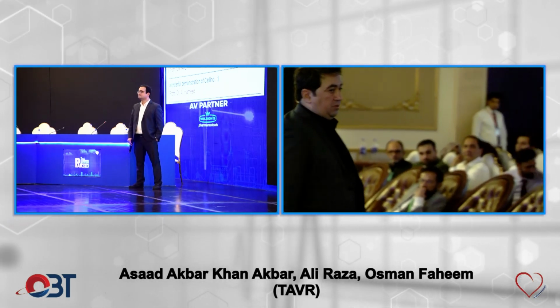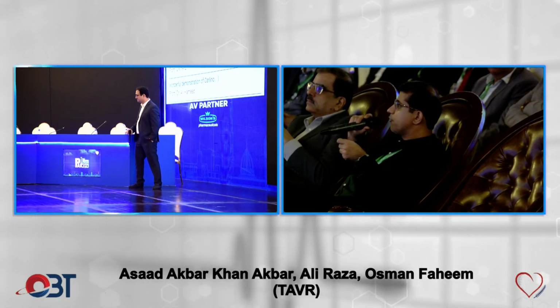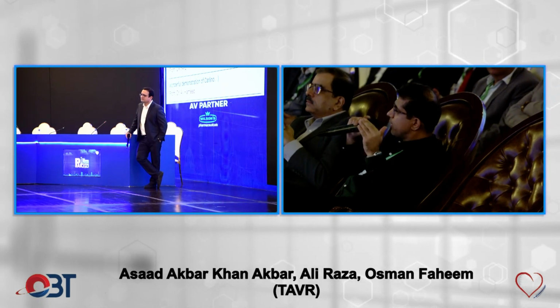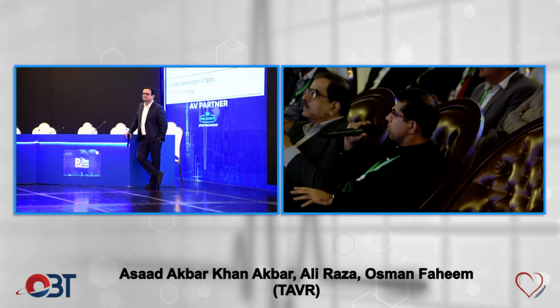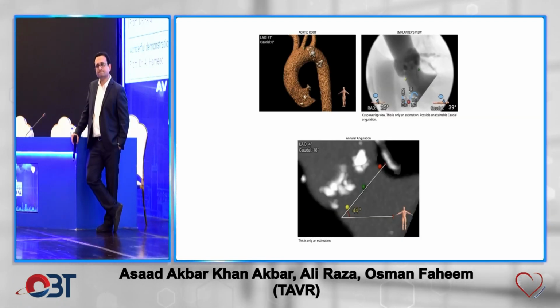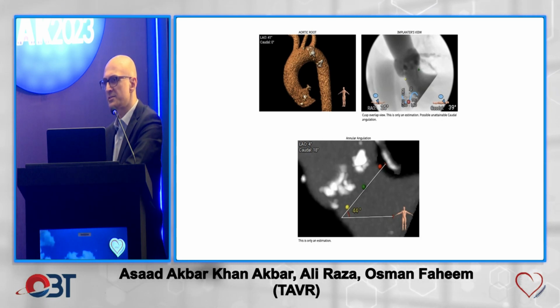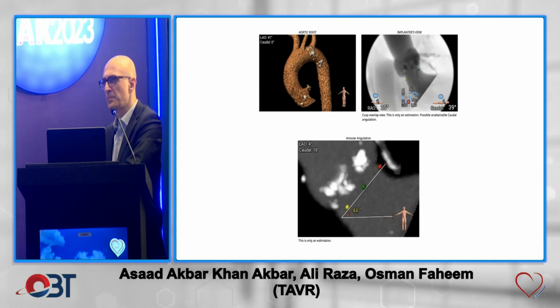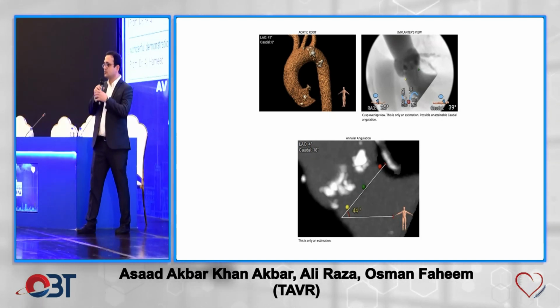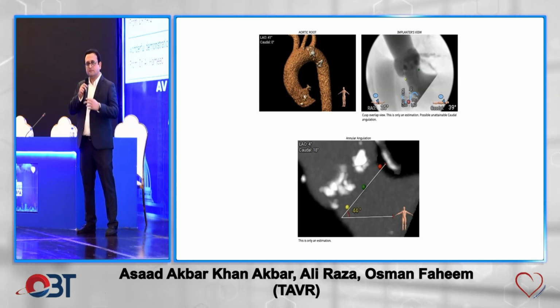Regarding oversizing self-expandable valves, जैसे आपने कहा balloon expandable में there is a limit, 15% से ज़्यादा नहीं कर सकते, तो उसमें कोई limit है, 20 से ऊपर या कितना कर सकते हैं? So generally self-expanding you want to oversize about 20%. You want it to be a little oversized. And balloon expandable you want to keep the oversizing less than 15%, क्योंकि self-expanding is going to anchor based on its radial strength. ना उसको आप कम oversize करेंगे, it might not fit there. और हाँ, यही मेरा ख्याल है.